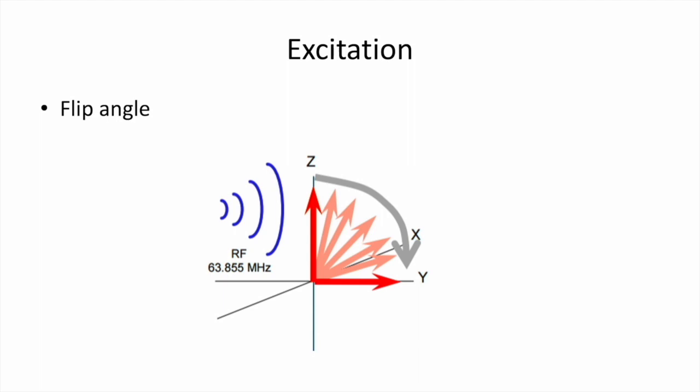As we all know, human MR imaging is dependent on the hydrogen protons in organic tissue. When a human is placed within the MR gantry, the hydrogen protons align either with or opposite to the external field, with a net moment in the direction of external field, that is along z-axis. When an external RF pulse is applied at the Larmor frequency, the protons absorb the energy and are deflected into the XY plane. This process is called excitation, and the angle by which it is deflected is called the flip angle.